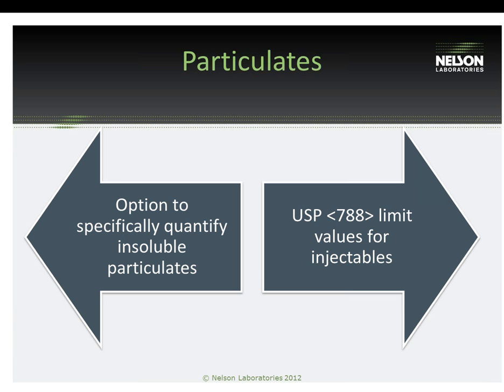So there is some overlap here, again, with the particulates and insoluble debris. And so you just kind of have to look at what total you want to look at, and then decide which test method, either one or multiple test methods, are going to be best at quantifying those surface residues.